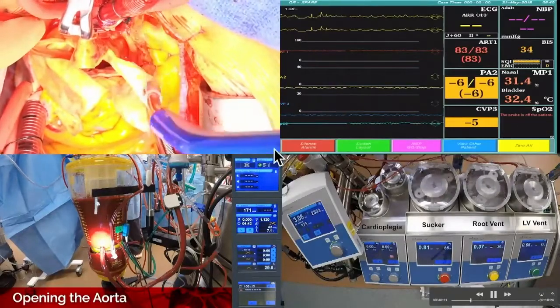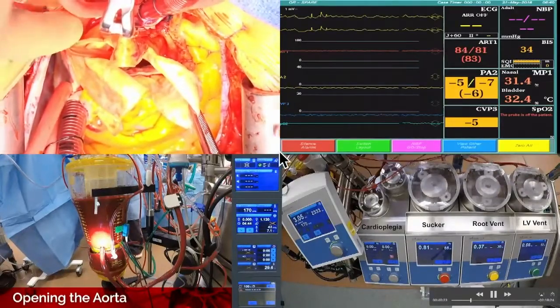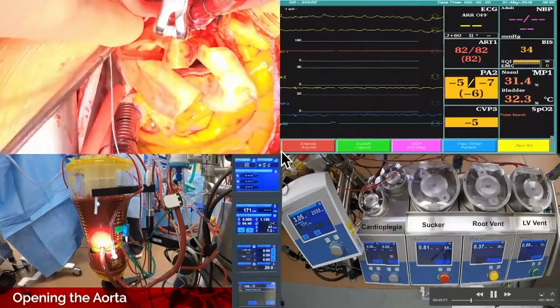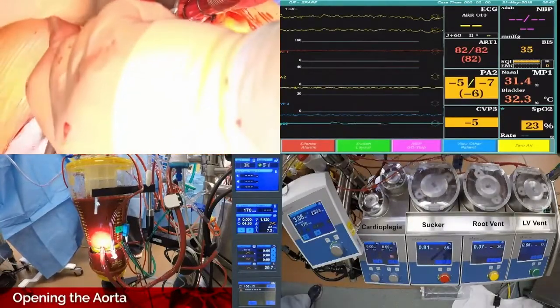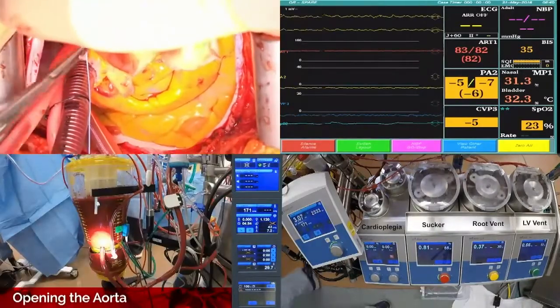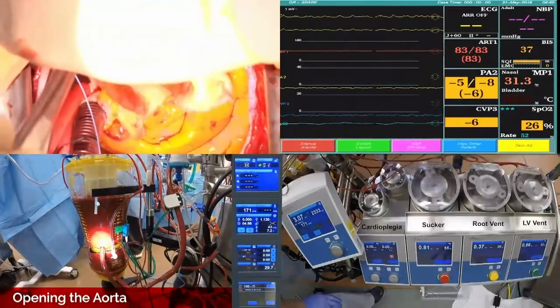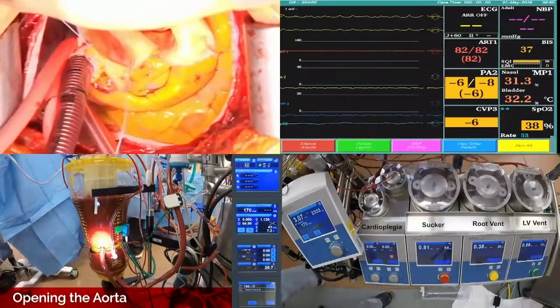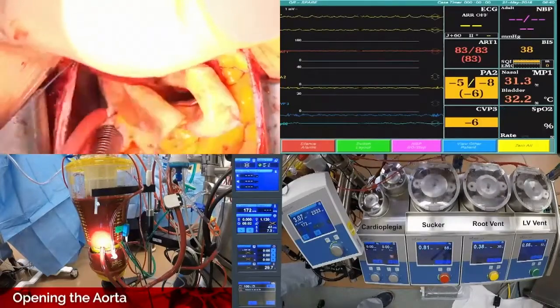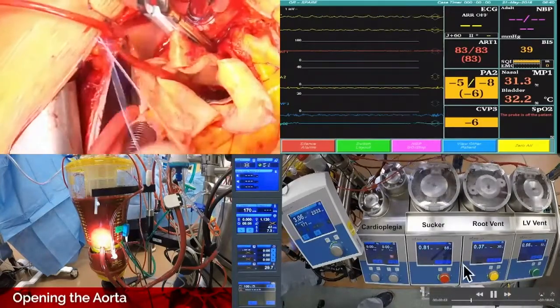And at first it's a little bit disturbing. It seems to be in the way, but you can put stitches in. You can use your Rumel tourniquets to hold it in place in other places. There's a lot of ways you can get it out of your way to do the surgery, especially in an aneurysm. It's pretty easy to get it out of there and ignore it because the annulus is pretty big typically.